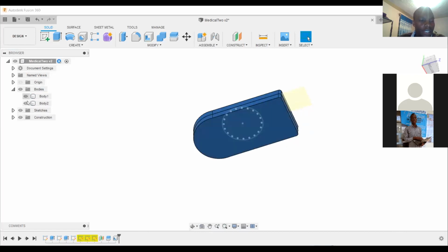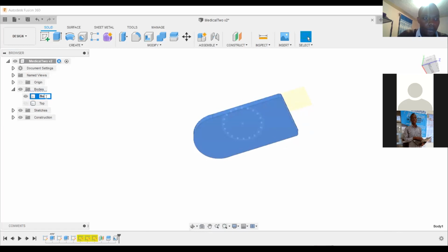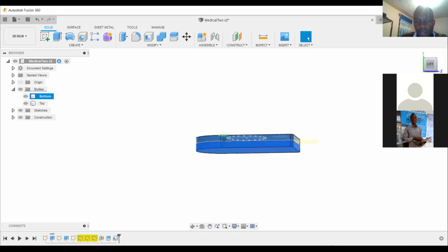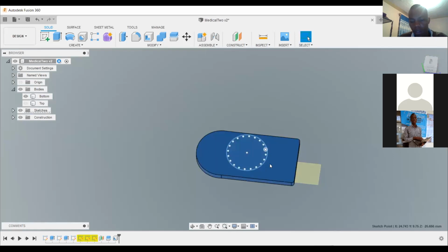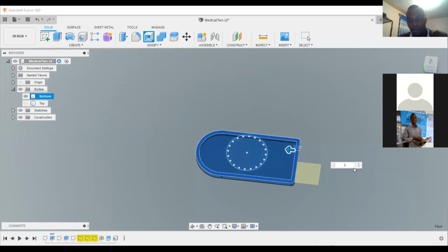Then, so this other one is like the top. You can always rename it there, top. Then this one is the bottom. So you can hide the top, and then you release the bottom. So this other one also you can shell. I want to show you the last thing, and then you shell with the two.